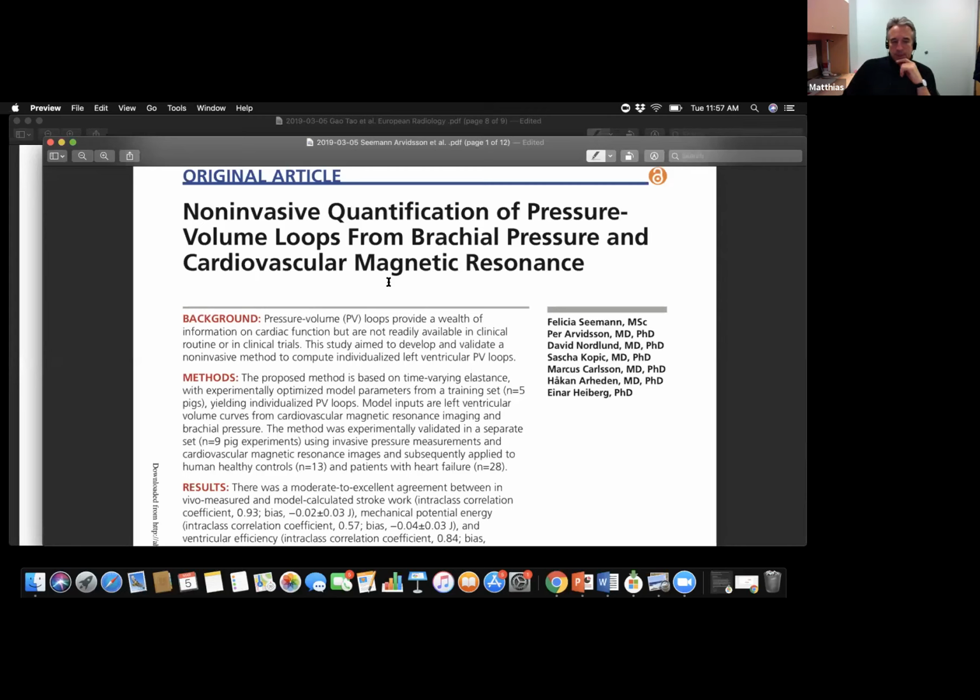Yeah. So I hope everybody has heard that. So who's interested in that, then approach Einar. Certainly, I will discuss this with my group. I think it's very interesting because it is using a standard sequence, so it could be using standard images, so it does not necessarily add to the length of the protocol, but it provides a clearly different marker that increases the number of data points we can derive from a CMR study.